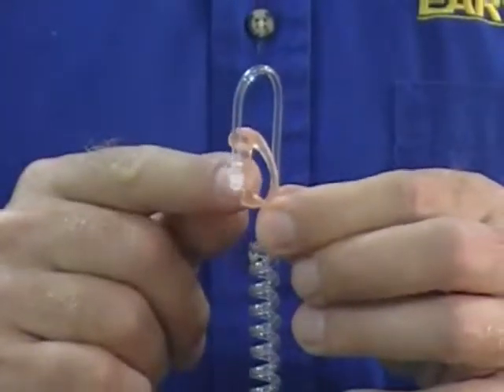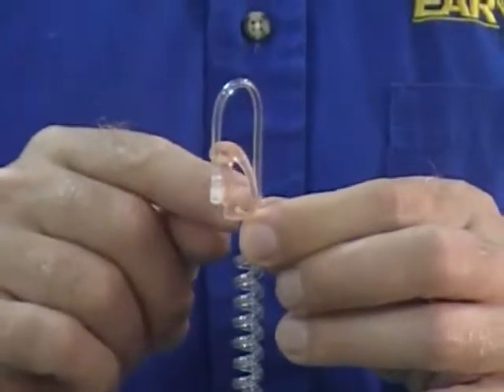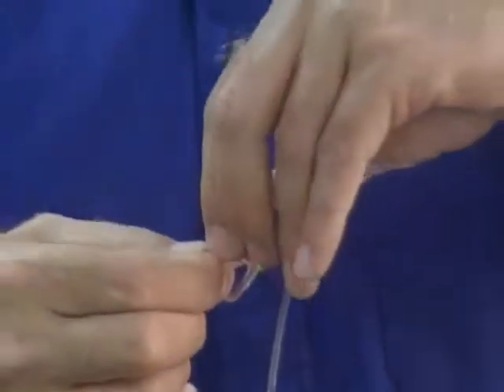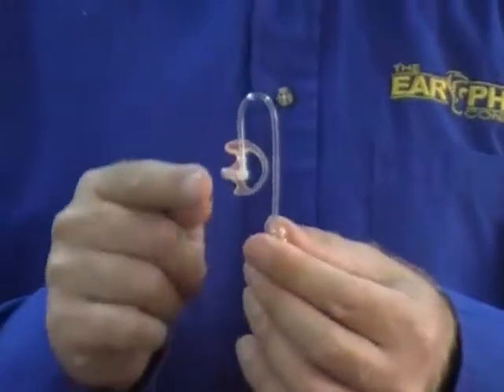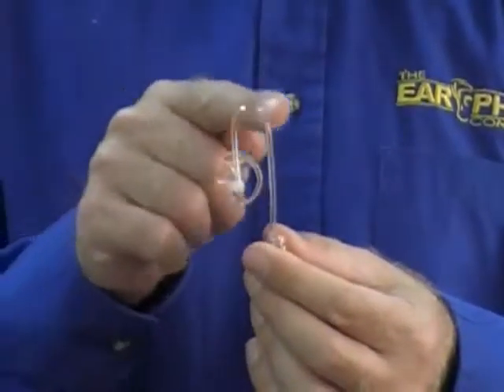What I always say is that the curve of the ear mold should follow the curve of the tube. I'm going to twist this slightly, and that's the way it should look — the curve of the ear mold following the curve of the tube.